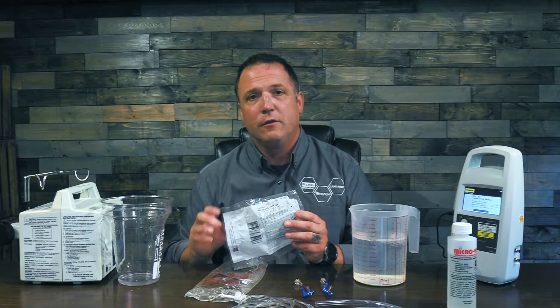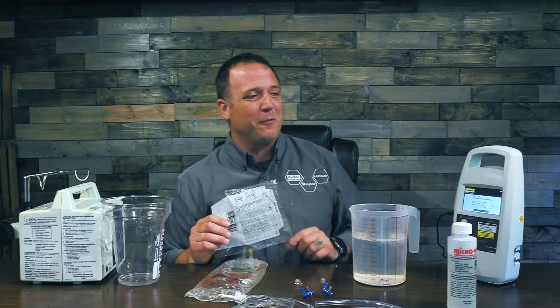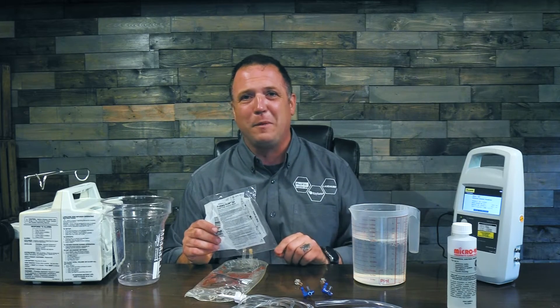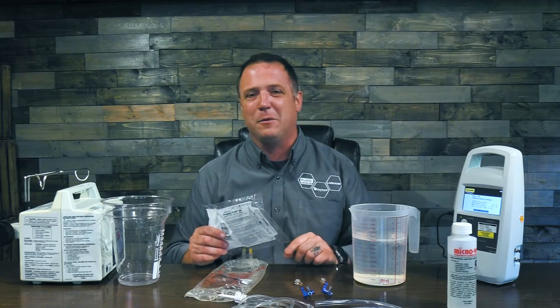Some infusion pumps require that you use a special calibration set, so make sure you have the right set. The one thing you'll notice I don't have on my desk is my operator's manual for the IDA1S — that's because I like to use the online version. If you go to flukebiomedical.com, go to products, go to the IDA1S, you can pull up the operator's manual right there. That way I always have the latest version, and you can also look for helpful videos on how to set up your infusion pump or other devices.